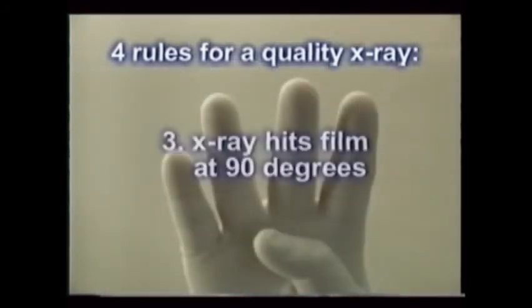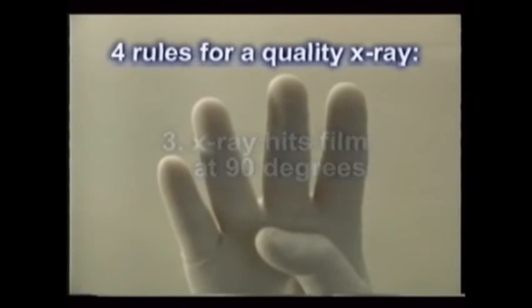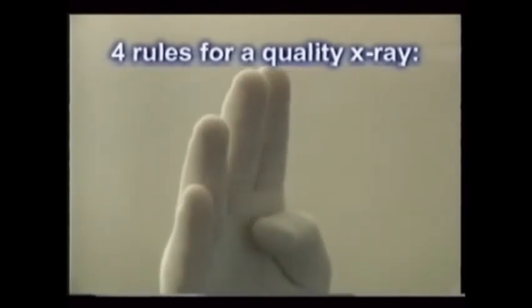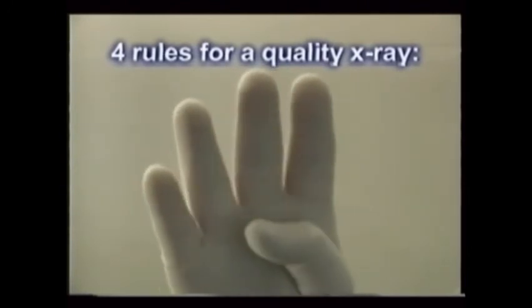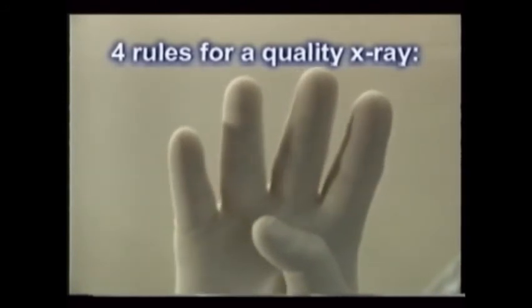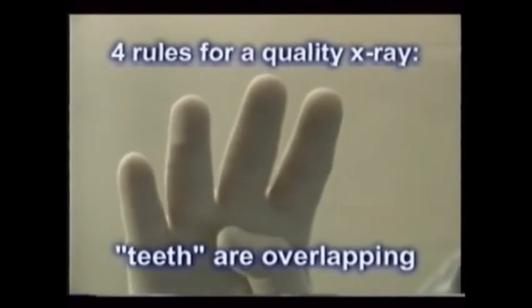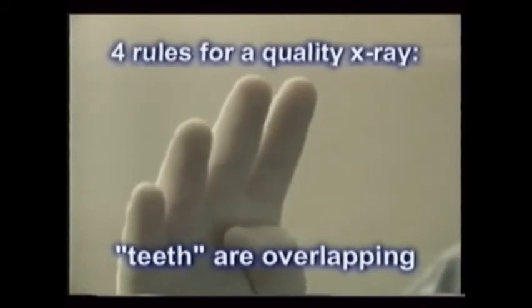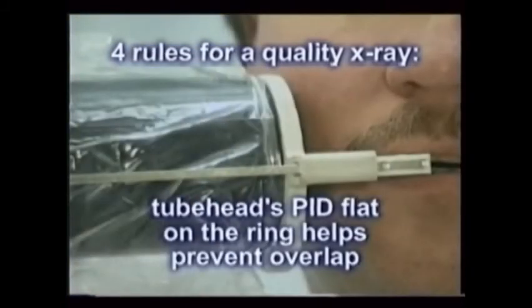Third, the X-ray beam must hit the film and the teeth head-on, 90 degrees, at a right angle. If you hold your fingers as if they were teeth in front of you, joined together and side by side, and then slowly rotate your hand, you'll notice that the fingers overlap as the spaces between them close. If your eyesight is the X-ray, the scene is becoming distorted. This is demonstrating overlap. Pay attention to placing the tube head flat on the ring.